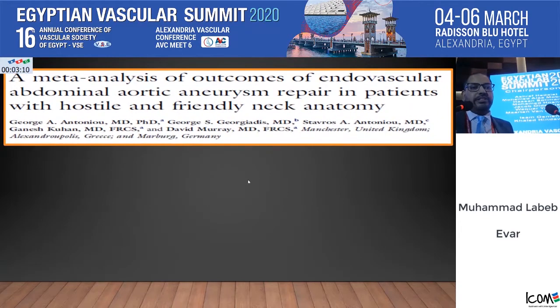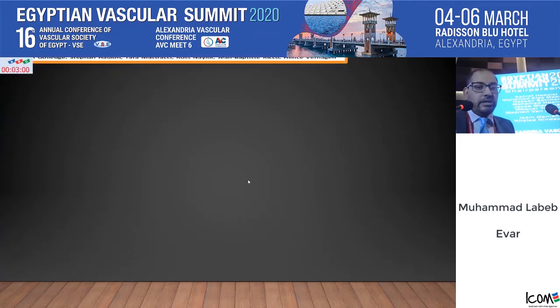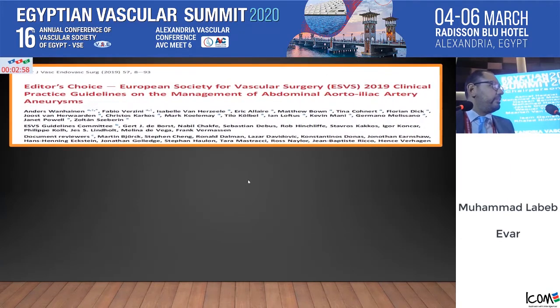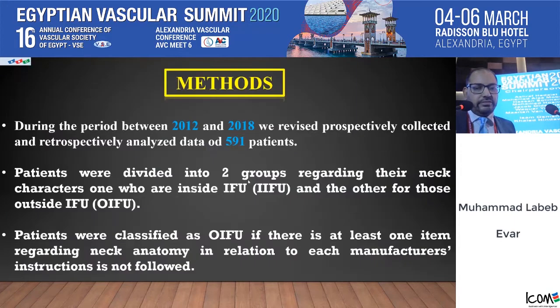A systematic review and meta-analysis, published in 2013, concluded that there is insufficient high-level evidence for or against performing standard EVAR in patients with hostile neck. Regarding the European Society guidelines, published in 2019, they report that outside instruction for use devices may have medico-legal implications in some countries.